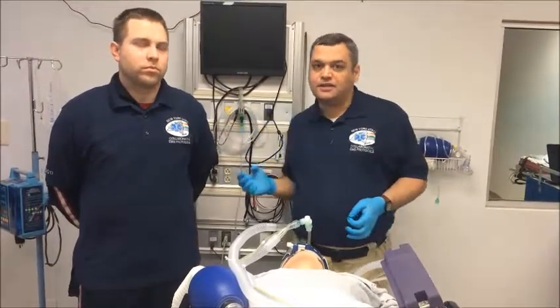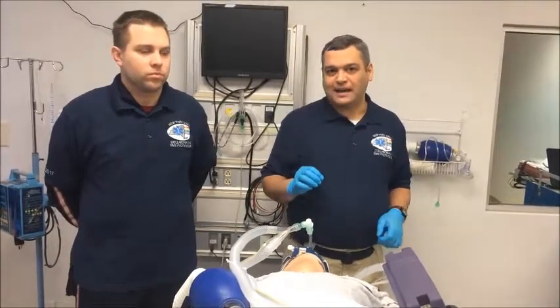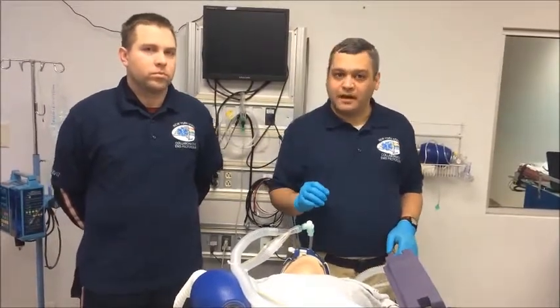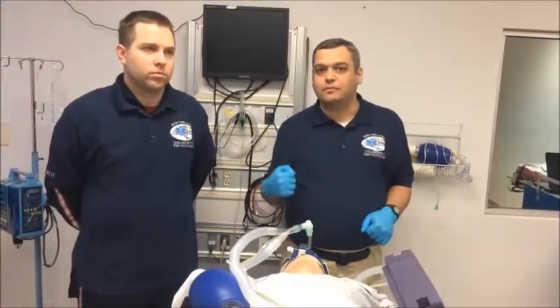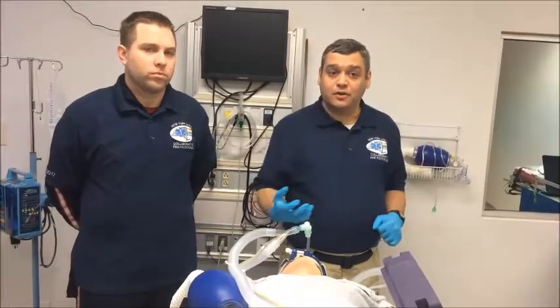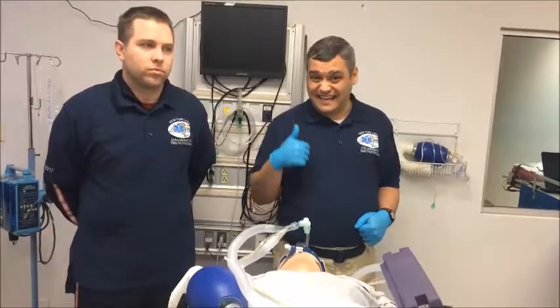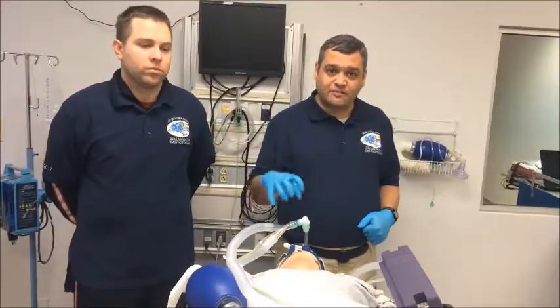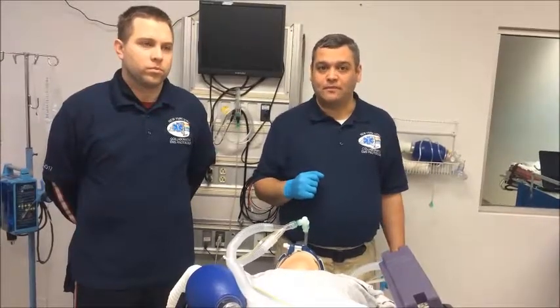And as Luke mentioned, if you do have an issue, don't forget about the DOPE mnemonic. I think that's one of the most helpful mnemonics that we have. And remember, it's displacement of the tube, obstruction of the system, if the patient develops a pneumothorax, specifically a tension pneumothorax, which the probability can increase when you have positive pressure ventilation. And lastly, of course, is E for equipment failure.